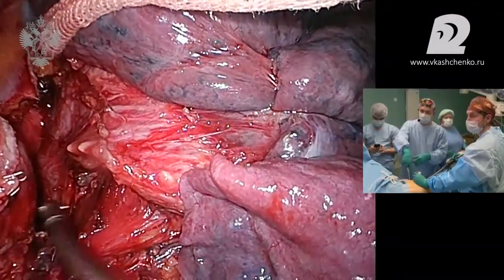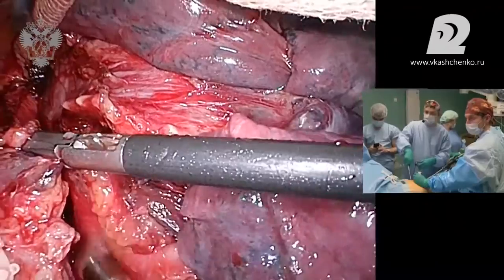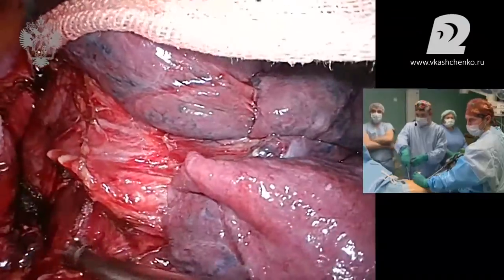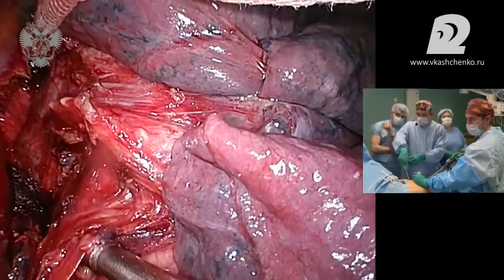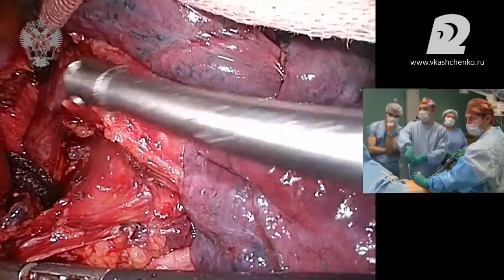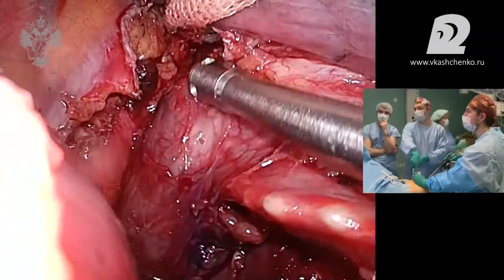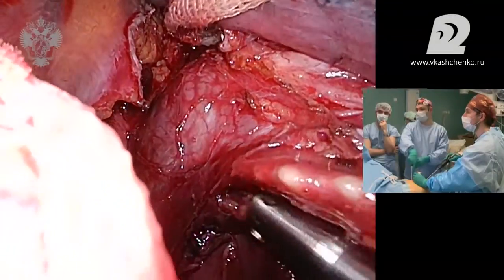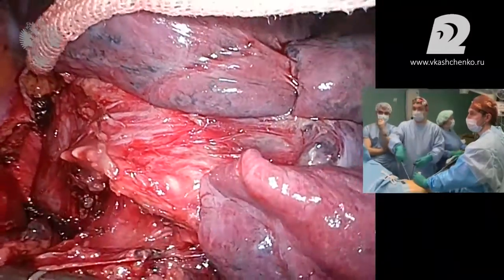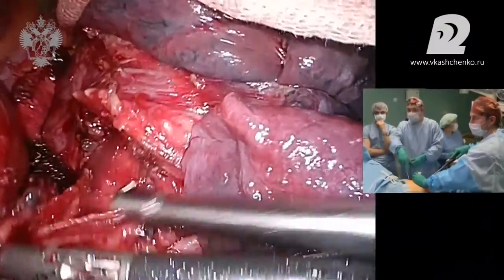I'm sure that there is kind of a defect because we can see small bulbs. We'll have to have a look at what is there. This is the intermediate bronchus. This is the right one, the big one. This is the bifurcation, and they're just sticking like this because of the membrane.